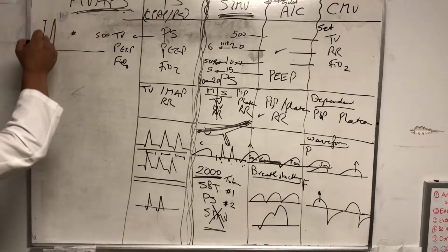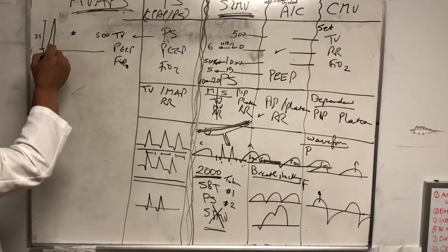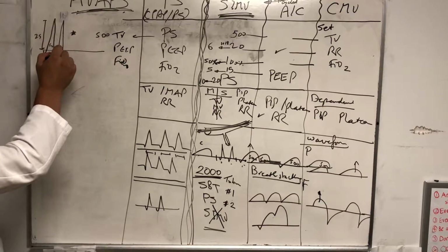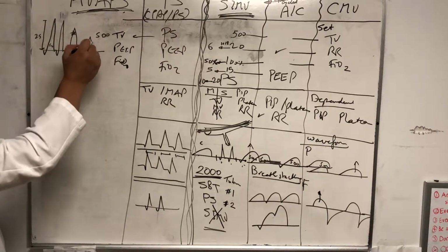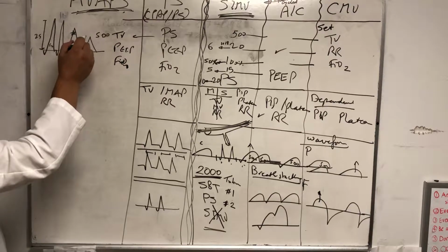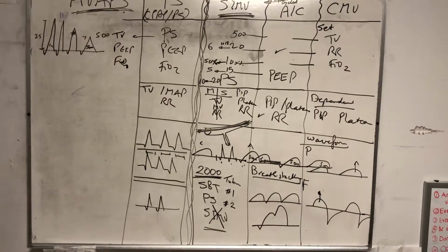That requires 25 of pressure support. So all of the subsequent breaths will be 25. Right, pressure support. And then you're getting better, for example, then the machine will go down on the pressure support until 7, for example, and pressure support will give you also 500 tidal volume. Right? And then you're ready to be extubated. So it can wean itself.